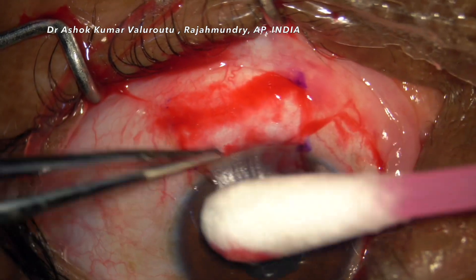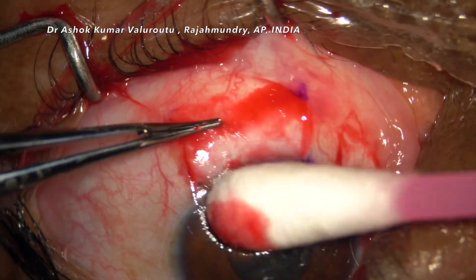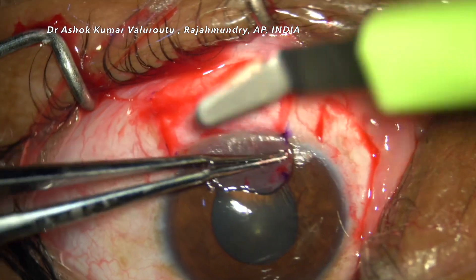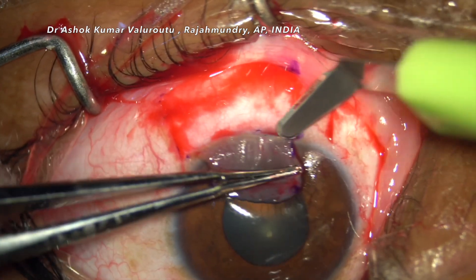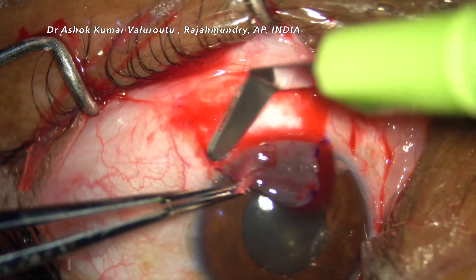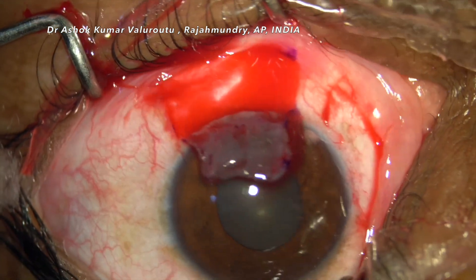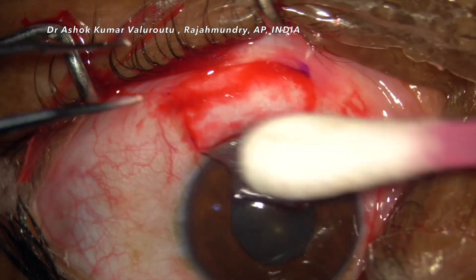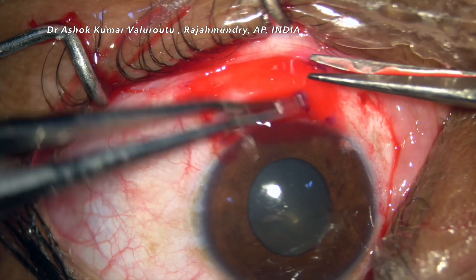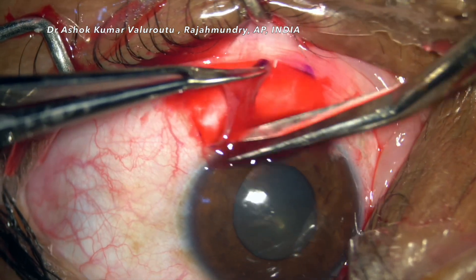We need to make sure that the Tenon's and the conjunctiva are totally separated without any adhesions. Once we are sure they have been separated, we separate our graft near the limbus. The main objective is to involve certain limbal stem cells. Once it is properly separated, it is separated from the limbus.